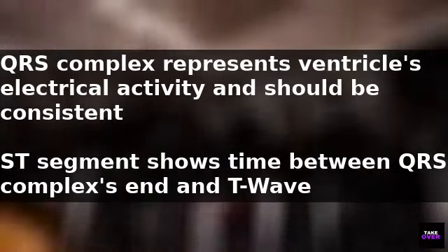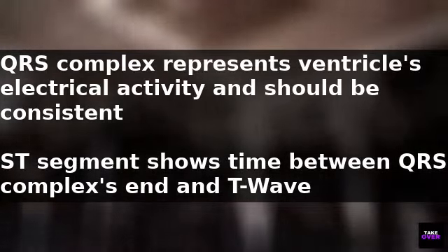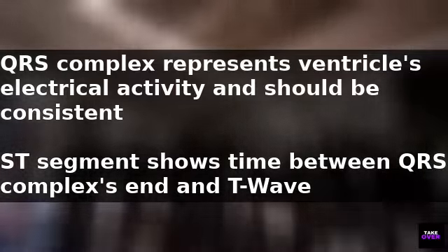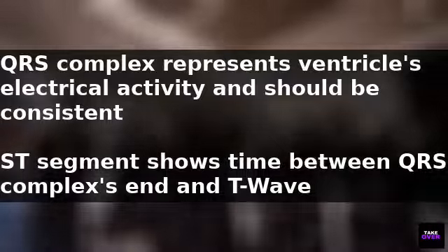The ST segment, showing the time between the QRS complex's end and the T wave's beginning, should be a flat line at the same level as the baseline.